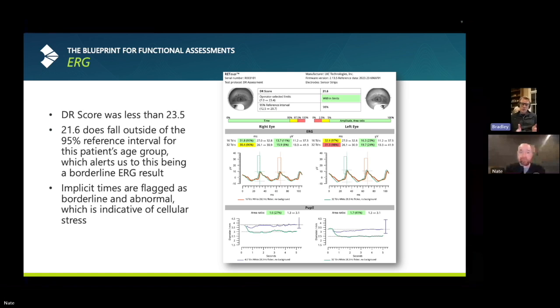On the other tests, on the PHNR, we have a case that we're working on right now that showed progression of about 20 milliseconds on a 6 months removed PHNR. So again, I would say if it's greater than 15% of the number itself, 100% and repeatable, I would count that. But for the DR score, I'm looking at baseline. If it's 3 points higher, then I know that that's doubling my risk factor based on the Burkell study. When you get more than 3, then the numbers get kind of goofy bad. But yeah, 3 points is significant to me, and I don't want them to get to that level. That's why I start at 1.5 to 2. And if we're trending, if it goes 0.4 and then 1.2 and then 1.7 and then 2, you're following that over time, so you can jump on that before that risk doubles to that patient. Yeah.